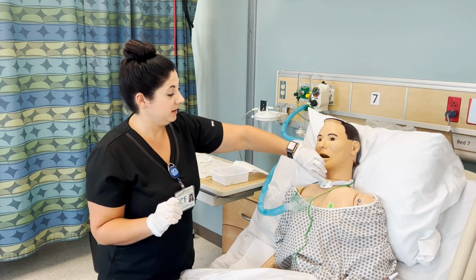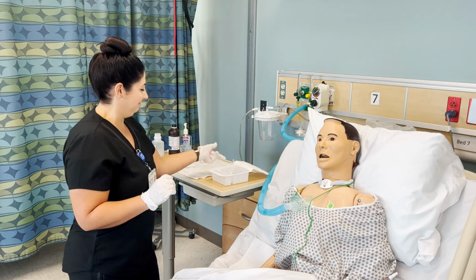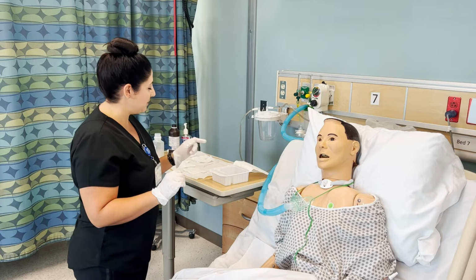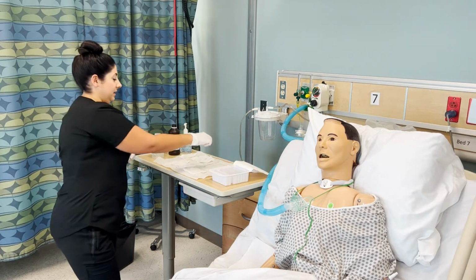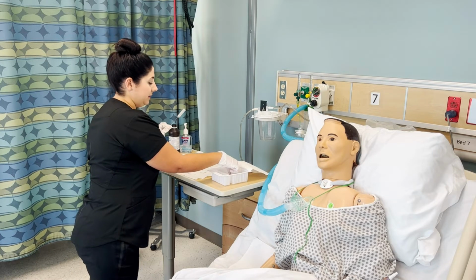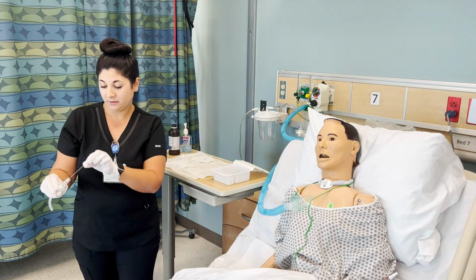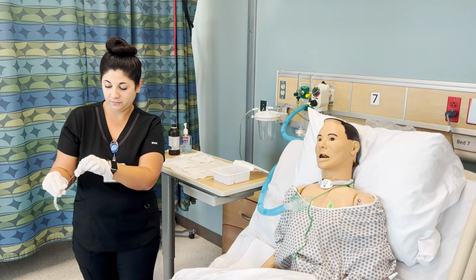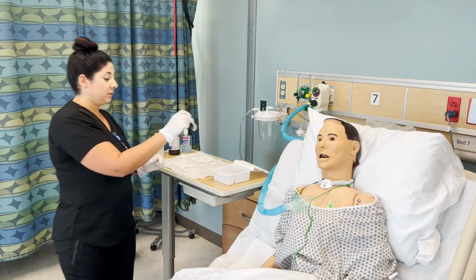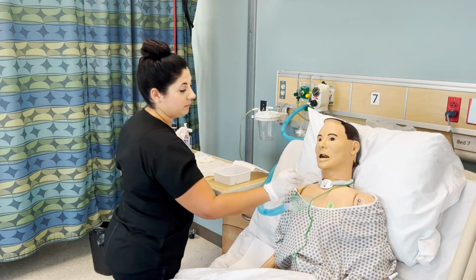Using my non-dominant hand that is not sterile anymore, I will twist to the left and pull that inner cannula out. It goes into the large section. When it has fluid in it, it won't jump out at you. Keep it in there, and using my sterile hand, I will grab the brush end here and transfer it to my non-sterile hand. Then I will use my sterile hand to pull the inner cannula out, kind of scooping the fluid in there so that it goes through. Over a trash can or a trash bag, clean the inside with this brush, making sure not to touch your non-sterile hand to your sterile hand. Once that's clean, it can go in the trash, and this will go into the saline. Rinse it a little bit, and then using your sterile hand, pull it out and replace.